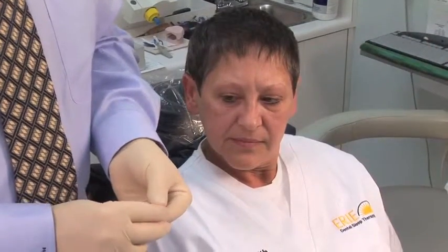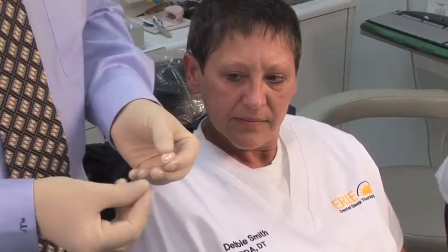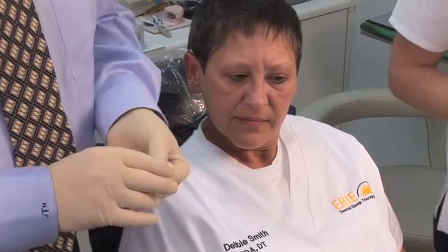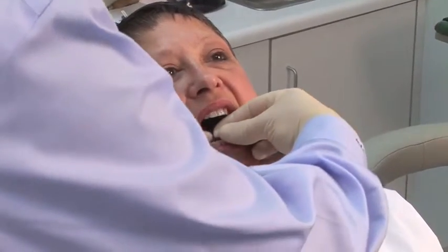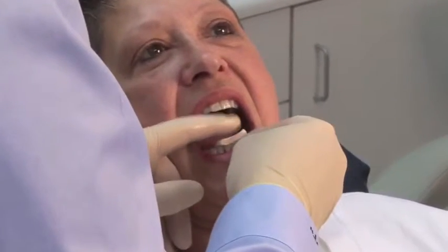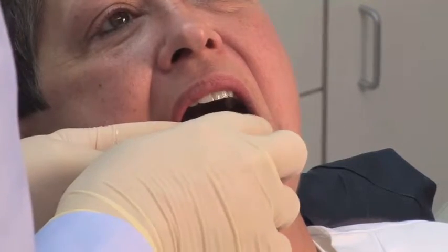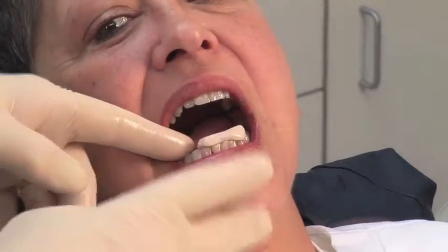I've removed our Thermacryl from our warm water, and I've placed some Vaseline on my gloves so this material won't stick to it. Once again, you can mold it into a little rectangle, and you simply seat it over the patient's lower anterior teeth.